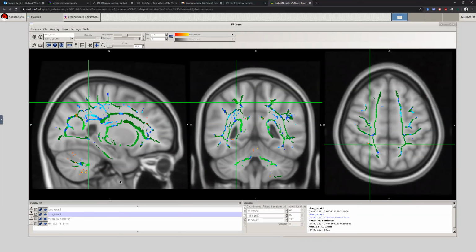We could sit there and count, and there are thousands of voxels in there. And so we're doing thousands of statistical tests. And if you know the statistical theory, we're going to have a lot of false positives with this, because something's going to show with the data and with the tests.